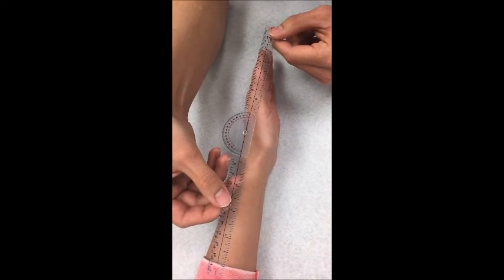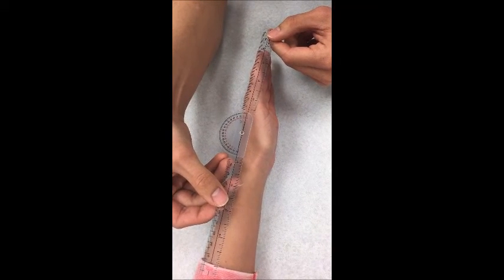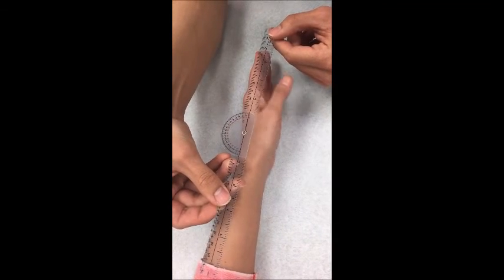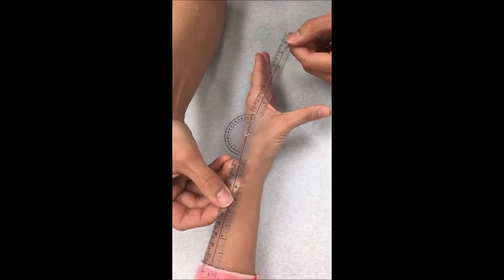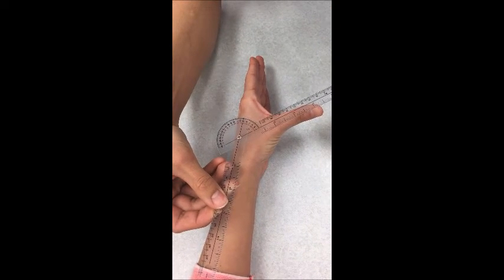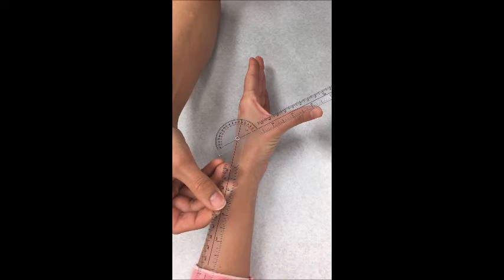The thumb is rotated so that it is at right angles to the palm of the hand. The therapist will ask the patient to abduct the thumb. The therapist will follow the thumb with the movable bar of the goniometer. Normal range of motion for palmar abduction is 0 to 50 degrees.